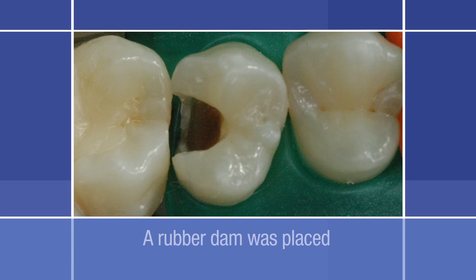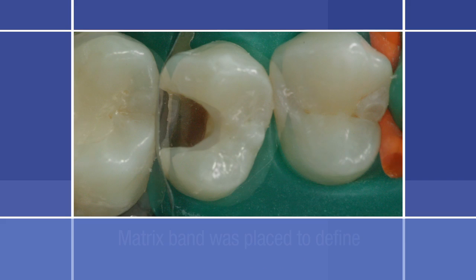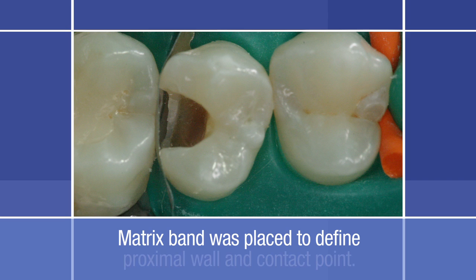Next, a rubber dam was placed for cavity isolation, which is recommended for composite filling placement. A sectional matrix band was placed to define the proximal wall and the contact point.